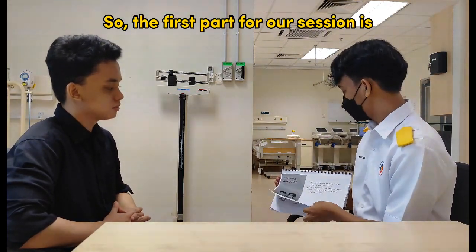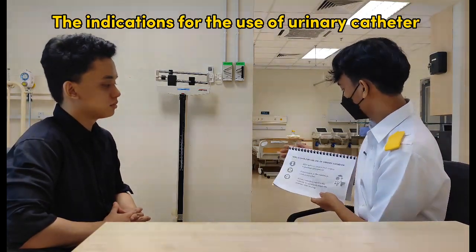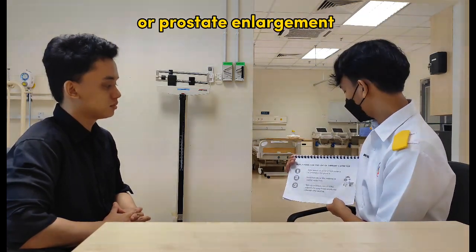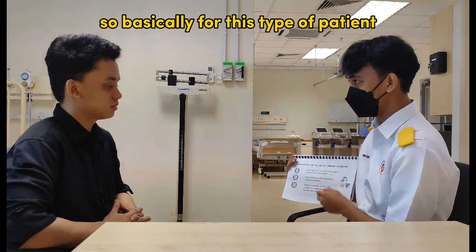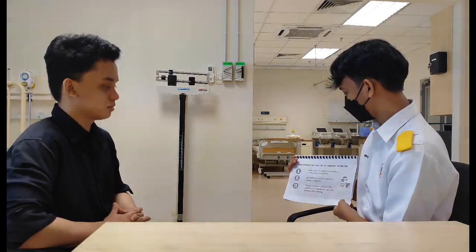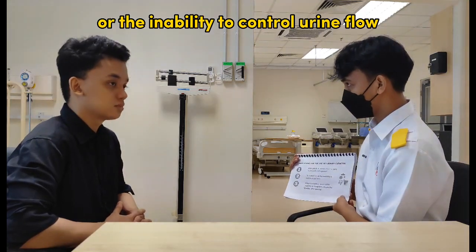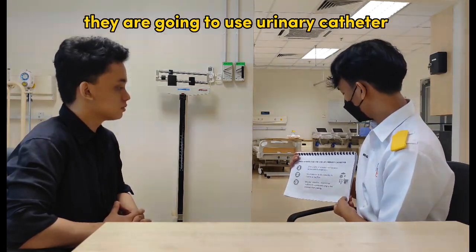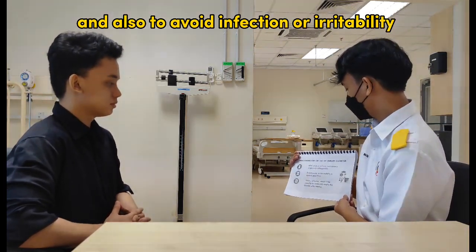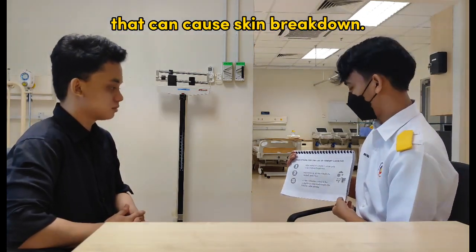So the first part of our session is the indication for the use of urinary catheter. The first one is for patients after pelvic or urinary tract surgery or prostate enlargement. Basically, this type of patient is going to use a urinary catheter for only a few days or few weeks. Number two is incontinence, or the inability to control urine flow. For this type of patient, they use a urinary catheter to help them pass urine, and also to avoid infection or irritation due to uncontrolled urine that can cause skin breakdown.